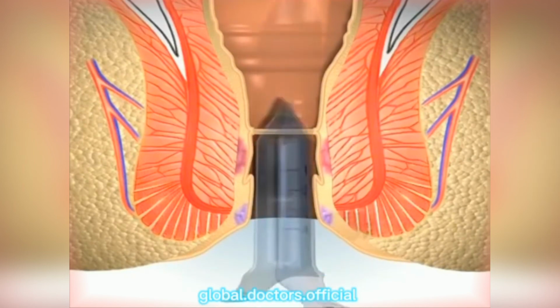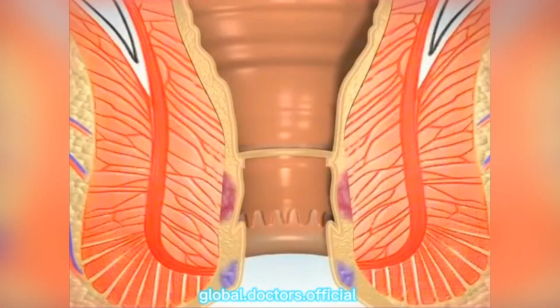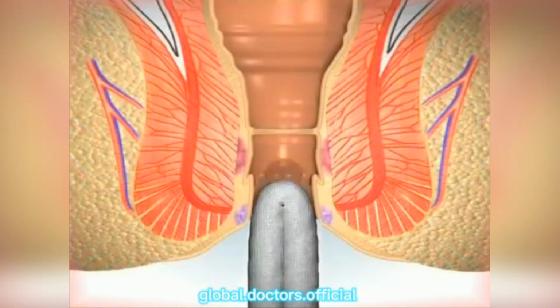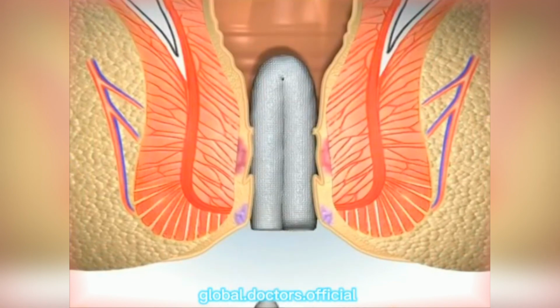The purse string suture anoscope is reinserted to facilitate the inspection of the staple line and application of sutures to any bleeders. Some surgeons may use Spongostan-like products to improve hemostasis, or a catheter to detect late bleeding.